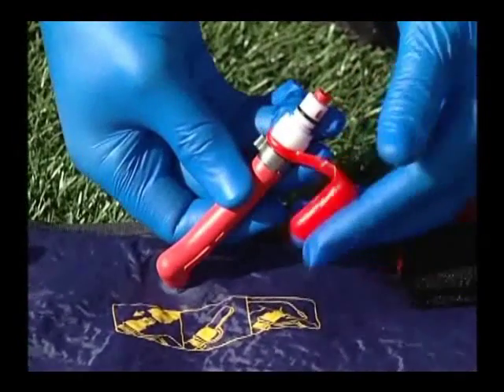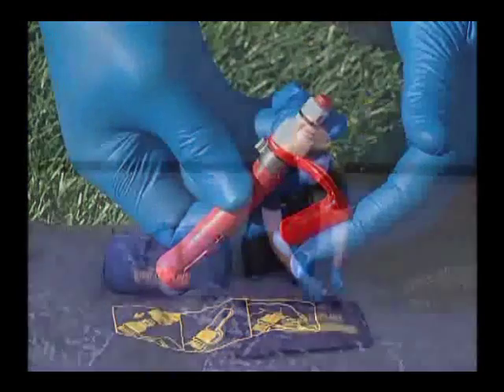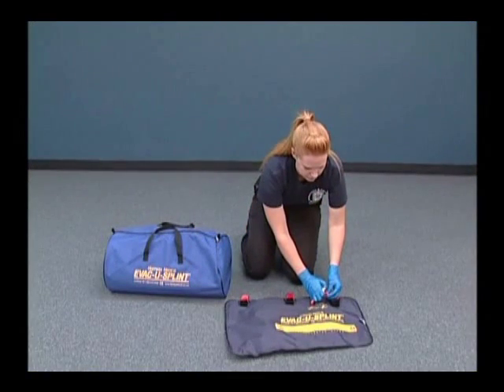Remove the red leashed cap from the maxi-valve and push in on the red end of the valve to equalize the air pressure in the splint.